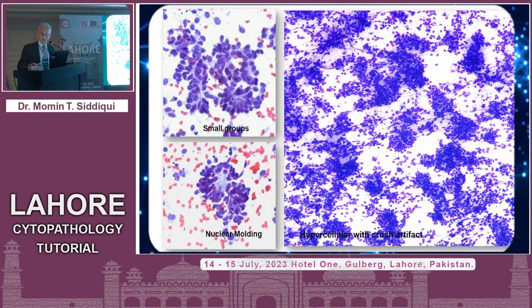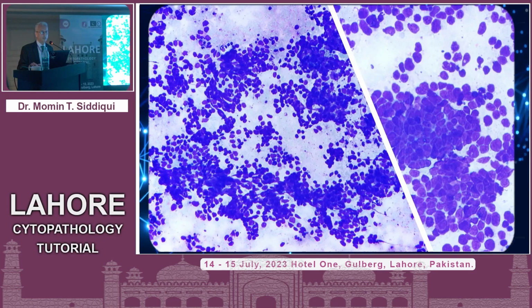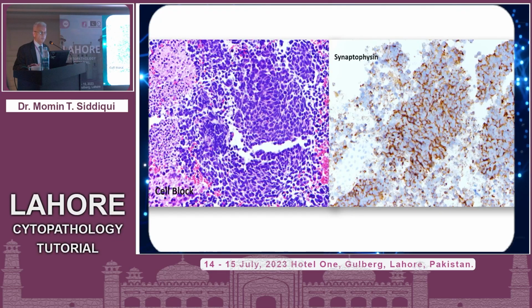More on that. Small cell neuroendocrine carcinoma will certainly have scant cytoplasm, but nuclear molding and characteristic nuclear details are the key. Again, this is giving you a real clear outline of what the nuclei should look like, really molded, high N/C ratios, and then really quite characteristic neuroendocrine differentiation displayed by the chromatin pattern that you note in these images here.